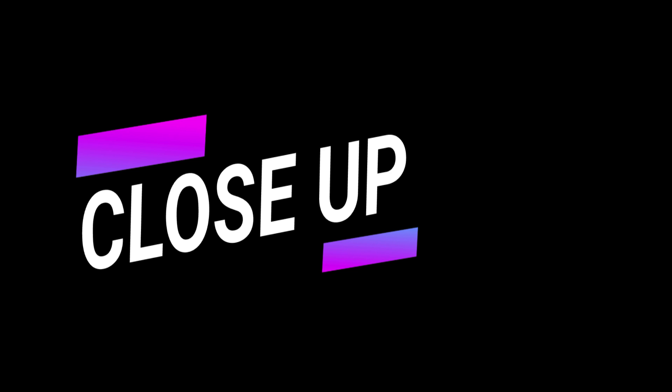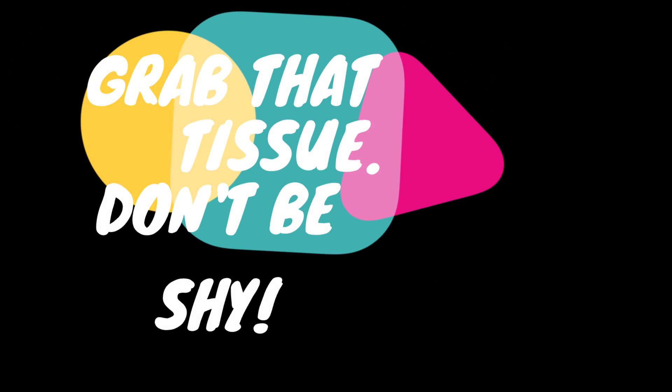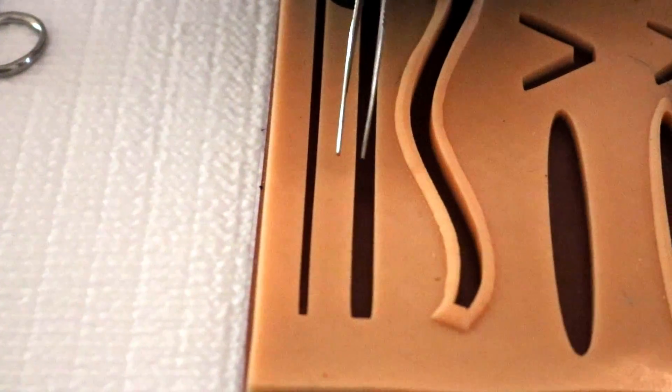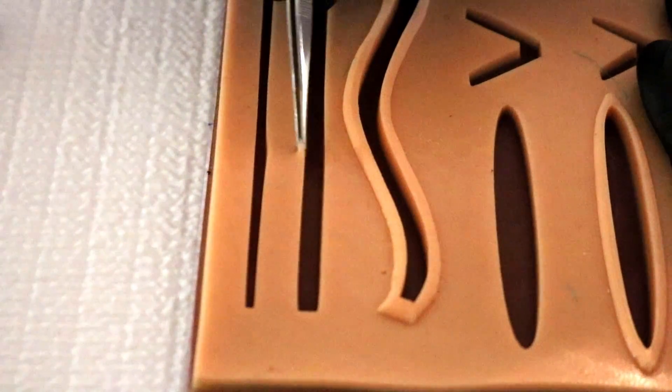Alright let's go ahead and get a close-up here and show you exactly how it looks a little bit more close up. There you go. Alright moving on to grab that tissue don't be shy. This is one thing I see my students doing wrong quite often is being just a little timid with that tissue forcep. Go ahead grab it.